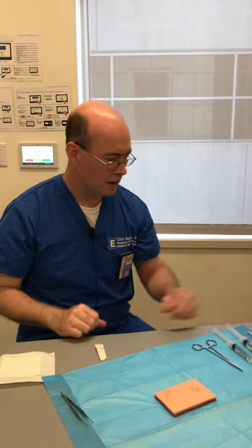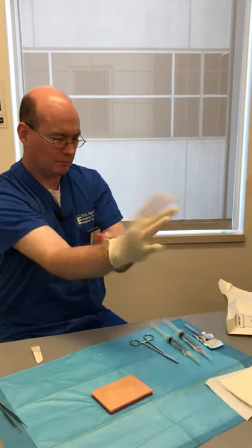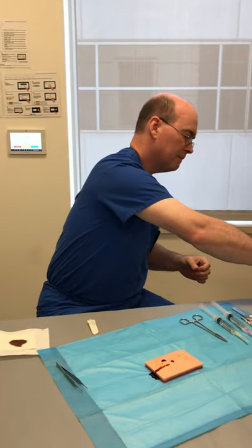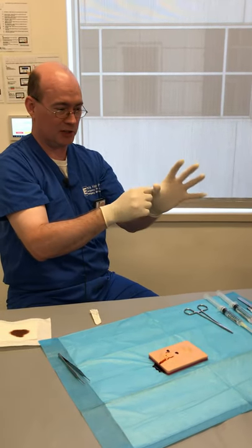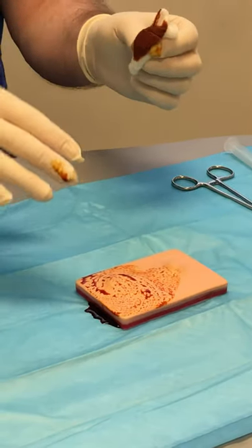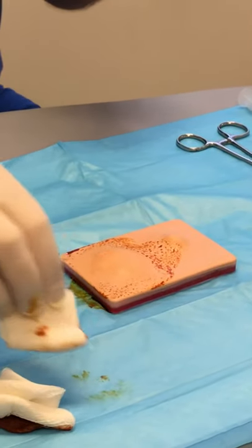Put on sterile gloves — they showed you how without contaminating yourself. Again, it's technically a sterile procedure, though it probably doesn't have to be; this is the kind of thing you clean your hands after instead of before. We'll betadine it up a little bit. These things hurt, so the patient will hate you when you're cleaning it and when you're numbing it, they'll love you when you poke it and the pressure comes off, then hate you when you're scraping the inside. In the suture set there would usually be a fenestrated drape with a hole in it to cover everything and establish a sterile field.